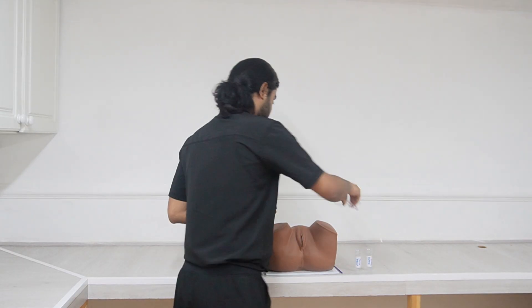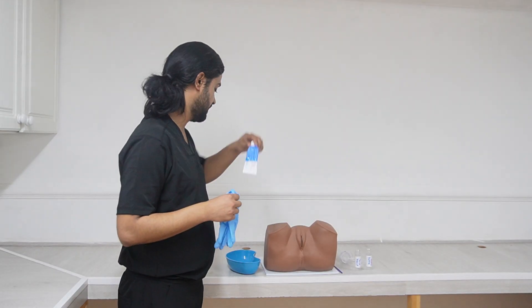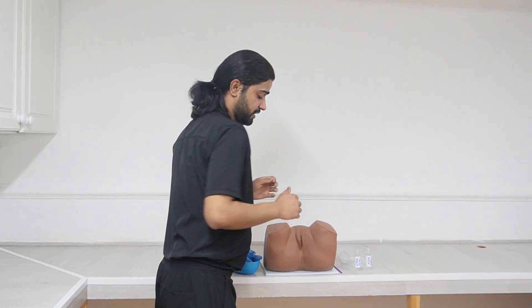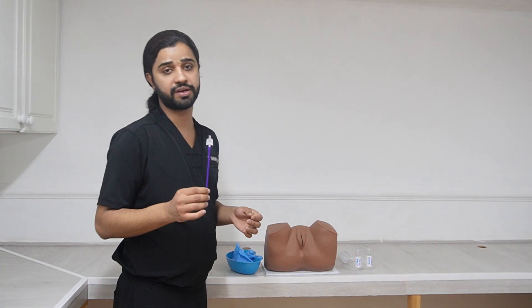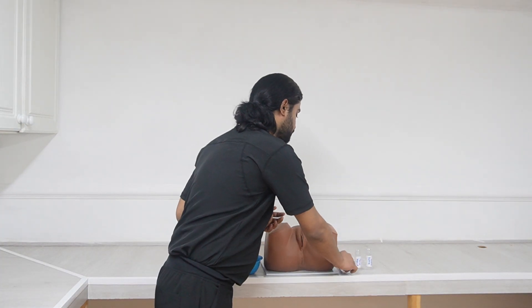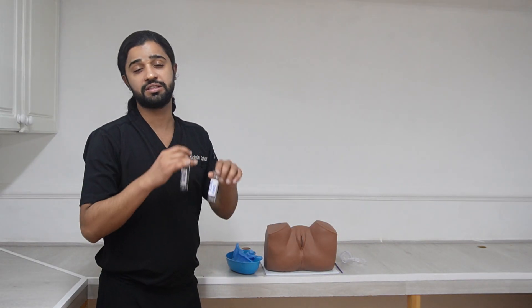Next we need gloves, and we need lubricating gel. If it is indicated to do a pap smear, we need a cervical brush and one of two solutions will be available: either ThinPrep or SurePath.